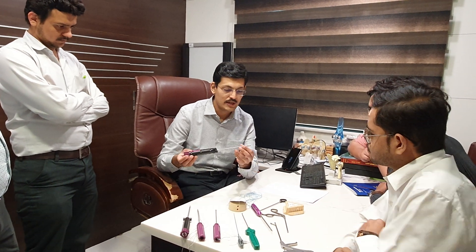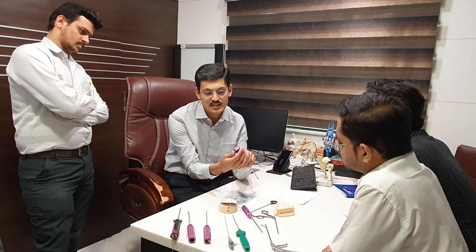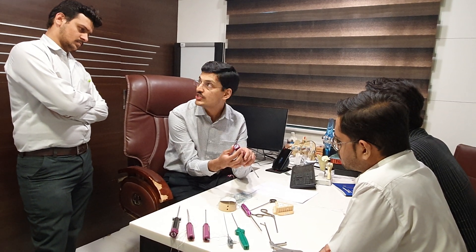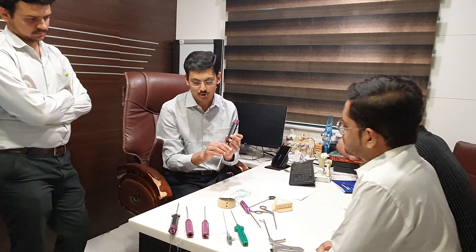This is called the Quattro LR anchor. It features a tension device which can tension the threads, and then there are different mechanisms to lock it. We will demonstrate that shortly.